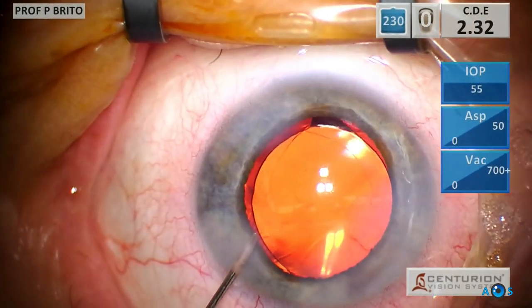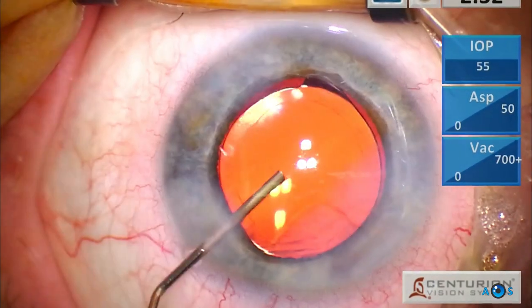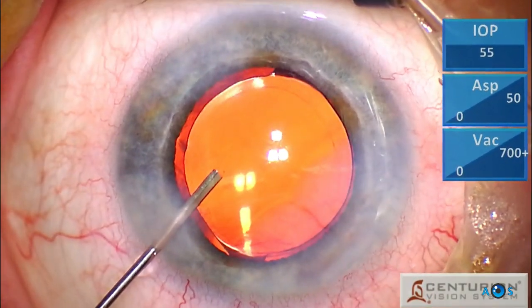Inject antibiotic and perform a small adjustment of the IOL in order to center the round wavefront shaping element with the corneal light reflex.